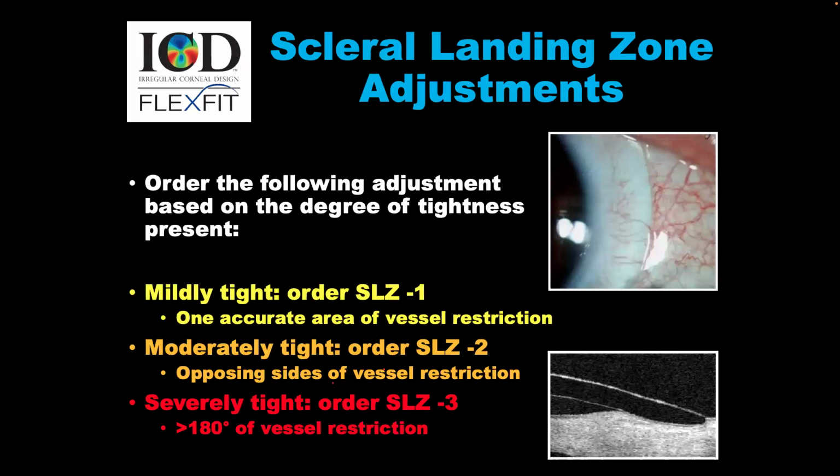So as I mentioned before, the 16.3 is a dual depth lens, and those markers that you saw on the picture, and if you want, I can go back, those markers were actually pointing out where the flat meridian is. And as I mentioned before, the toricity of this lens is basically done on the steep meridian. So you will see the flat meridian marker.